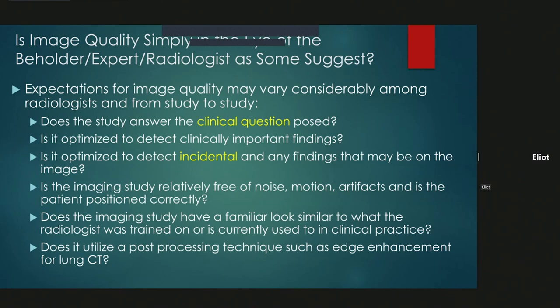Is it optimized to detect incidental findings, or any findings that might be on the image that were not part of the reason for the examination? Is the imaging study relatively free of noise and motion and artifacts? And is the patient positioned correctly? And does the imaging study have a familiar look, as to what the radiologist was trained on or is currently using in clinical practice? And we certainly see the vendors really emphasizing a particular look or feel for the reconstructions that they do, and essentially suggesting that there are significant advantages for one vendor versus another.